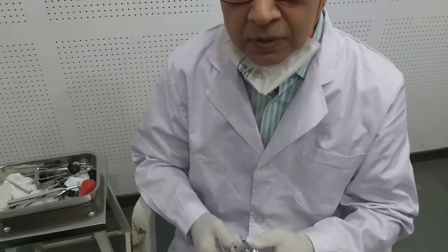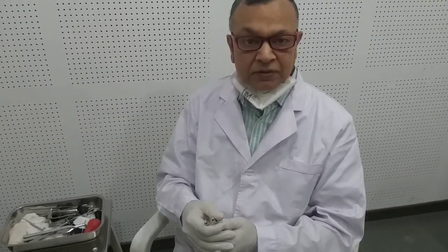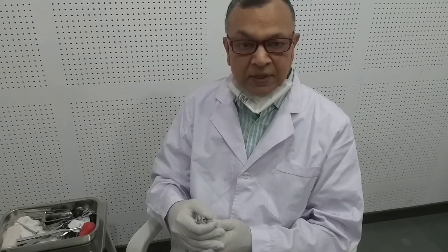Now first I will show you the Rinne's test. In Rinne's test, we compare the air conduction with the bone conduction. Normally, air conduction is better than bone conduction. If air conduction is better than bone conduction, we call that Rinne's positive. If it becomes just reverse — if bone conduction becomes better than air conduction — that is called Rinne's negative, and that occurs in cases of conductive hearing loss.